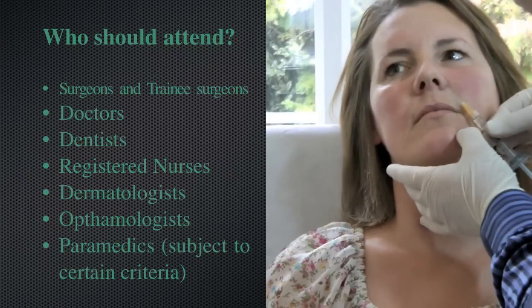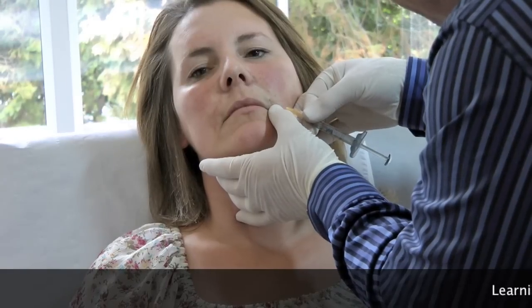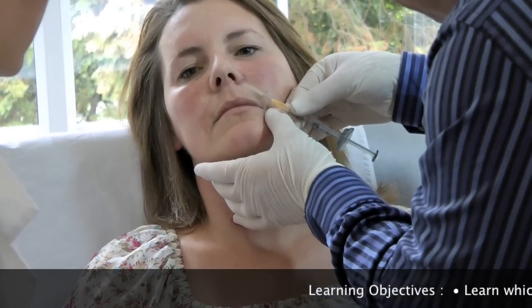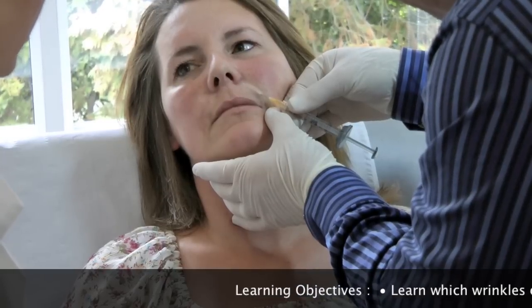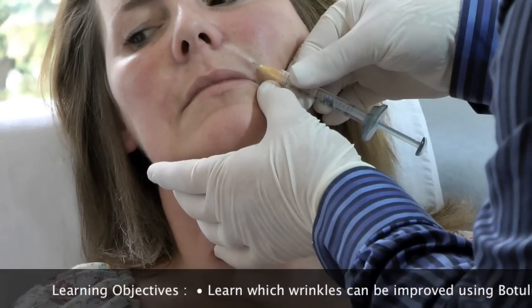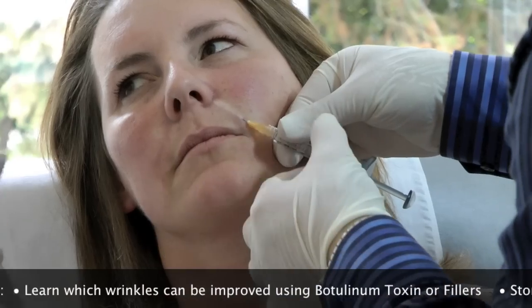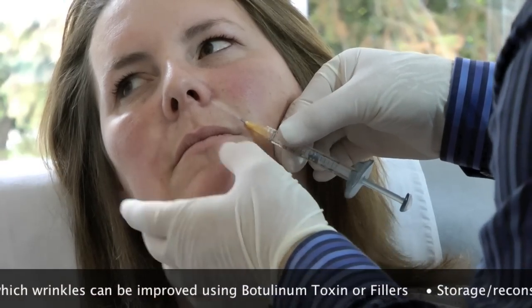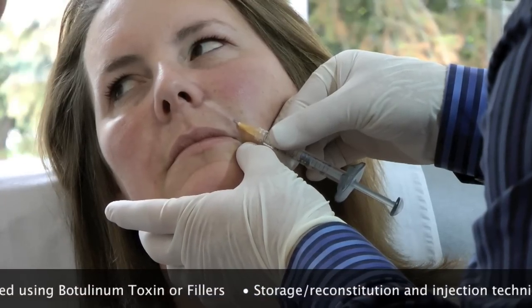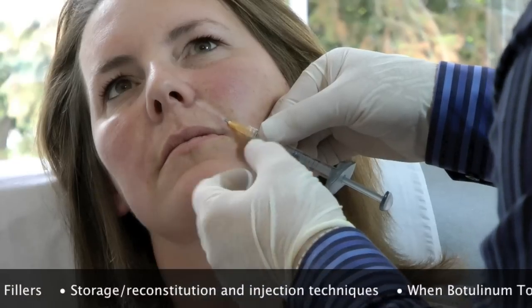To go there? Yes, lovely. You're following the contour of the face very nicely. So you can see that you're not going to be too deep, you're not going to be more superficial. And just feel where the end of the needle is lifted. You can just take it a little bit more. That's it. And then fill that area.